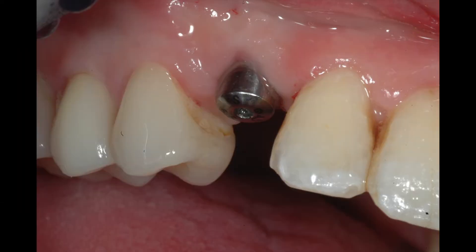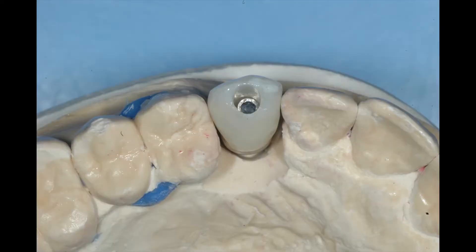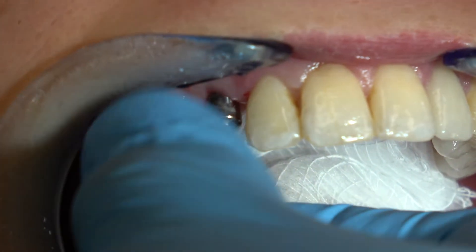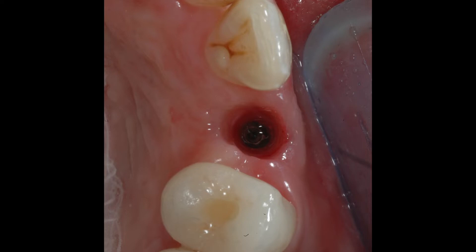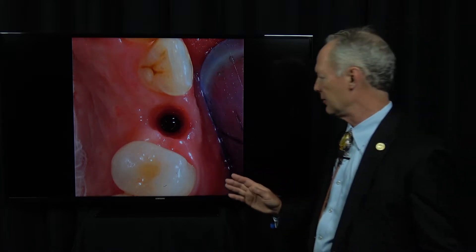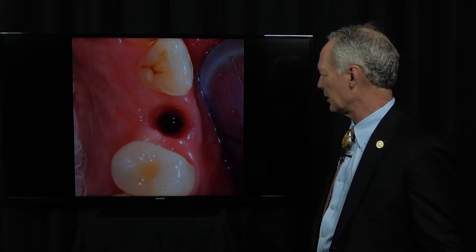This patient came back to the office after three months of implant osseointegration. It's well positioned. Here's the screw-retained implant, abutment, and crown. I'm unscrewing the healing abutment. See how our emergence profile is good. I'm going to give you a hot tip in a minute on how to avoid loose screws or screw loosening with screw-retained abutments and crowns.